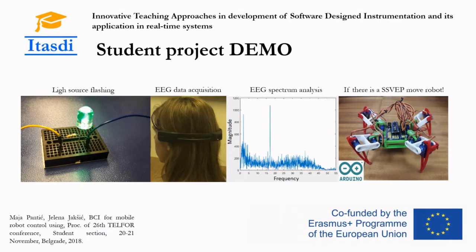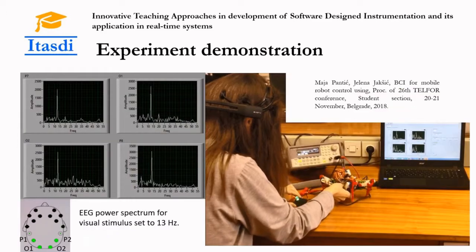During their experiment, the subject looks at the light-emitting diode, and the application acquires EEG signals from 4 electrodes positioned in parietal and occipital regions. Real-time monitoring of EEG power spectrum is implemented, and the small Arduino-based spider robot will move if steady-state visual evoked potential is detected.